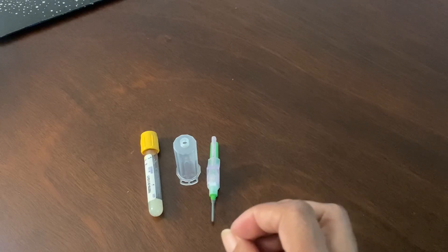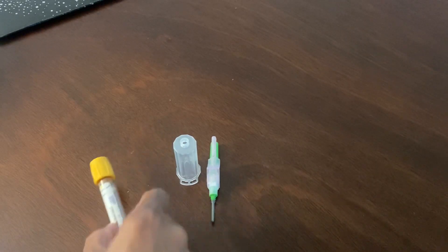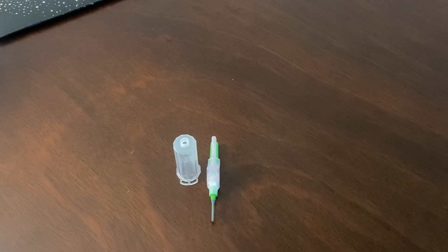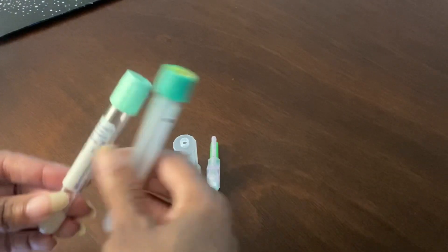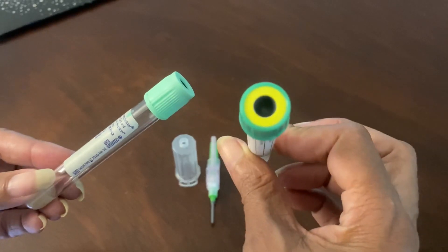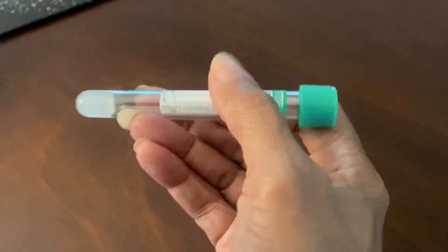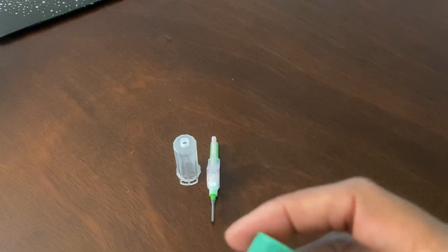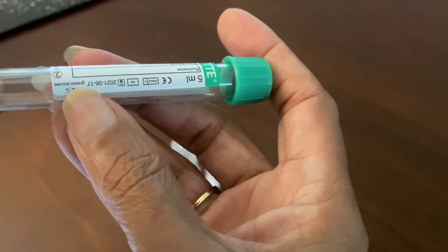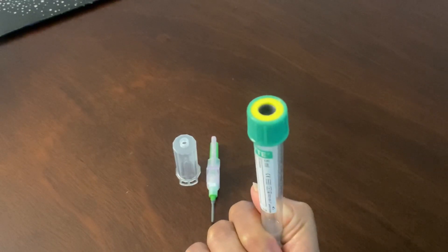The reason I'm going over this is because you guys need to know and understand that there are two big manufacturers. I like to talk about the manufacturers because you guys will see — I'll show these two tubes because they differ. You will see tubes like this, and this particular manufacturer is called Greiner Bio-One. The manufacturer's name is on the label, right here: Greiner Bio-One.